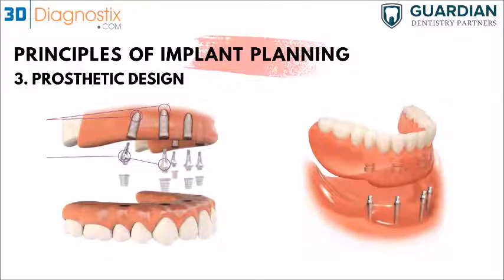If it's just as simple as one implant, we don't actually recommend having the session. What you can do is submit your case. You can just let us know what exactly you're planning to do, the implant you're planning on placing, the surgical kit you're going to be using, and we can go ahead and plan it, send you an email with the proposed plan, and then you can approve it. And usually the guide would take 3 to 5 business days to be in your office. So if it's a simple, straightforward case, you don't need to have that session.